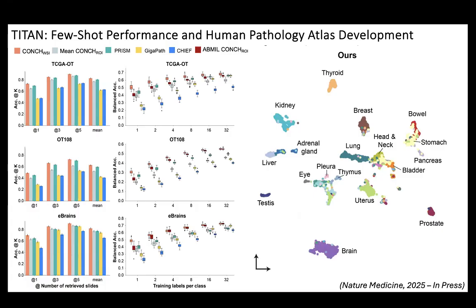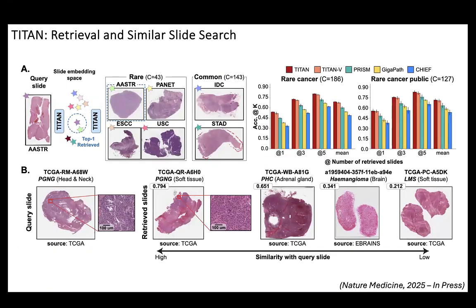Interesting ones include looking at few shot classification, because that would enable looking at clinical trials and seeing how few samples you can use to predict, for example, which next patient is going to respond to treatment, but also looking at image retrieval and finding similar cases. If you have a whole slide image and a single representation for the whole slide image, you can look at what are the similar cases in a very large database. This is how a lot of pathologists typically also analyze these cases, by saying that, well, this is an extremely rare case, and it resembles a case I looked at 20 years ago, and then you pull that and see what are the similarities. This is a more computational way of doing that and trying to find similar morphological features across large cohorts.